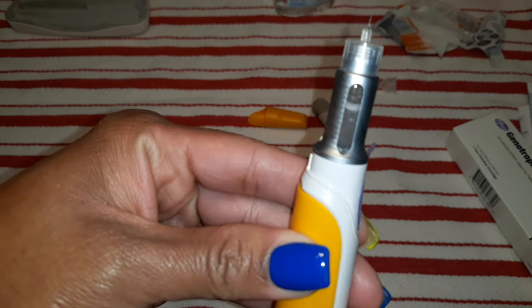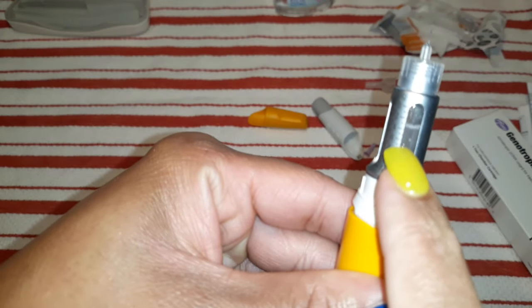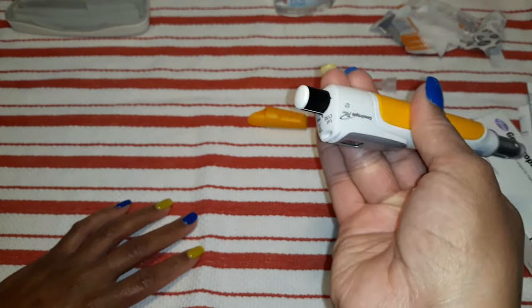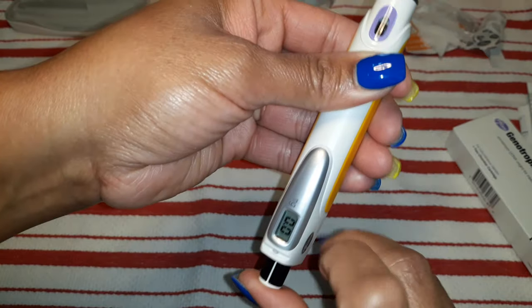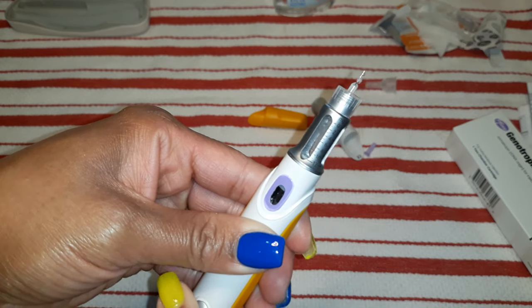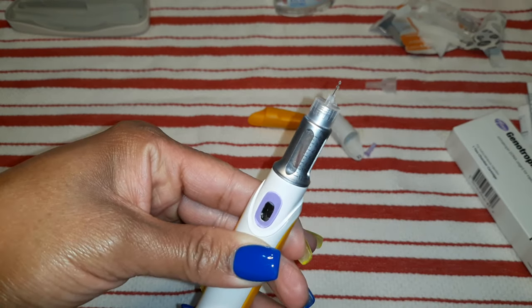And then you check it to see if you have any more powder in there. I have just a little bit of powder right here still. I'm going to check it again — and I don't. So now I'm going to push the button back up to release that air that's inside of there. Did you see the medicine come out? And that is how you load the pen.